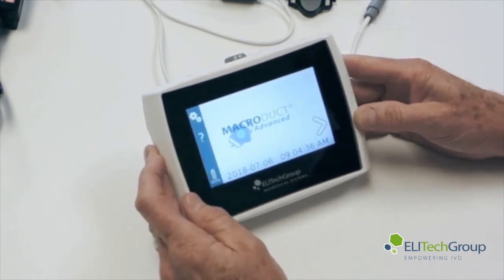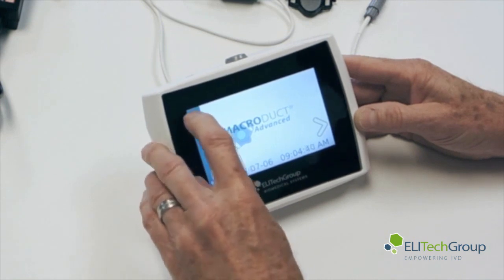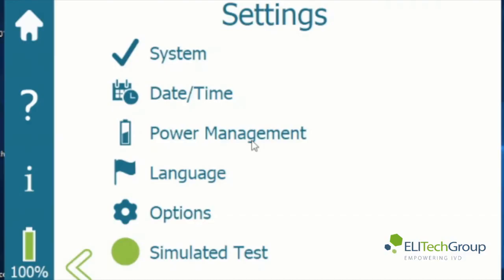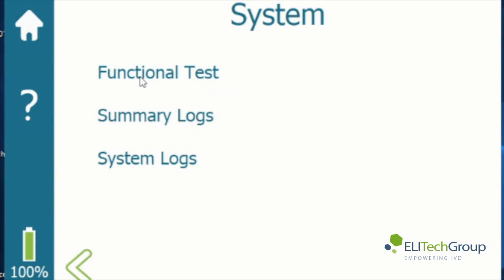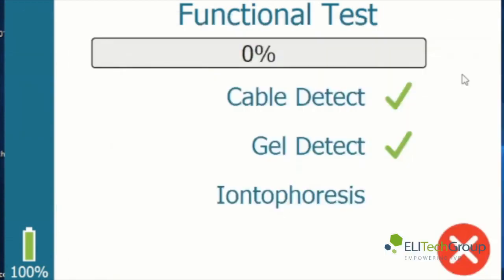Now if you press the gear icon it will take you to the settings screen. If you press on the system button that will allow you to test the system. Press the functional test, and you place a Pylogel disk between the red and black electrodes, then press the forward arrow button and it will test the instrument.